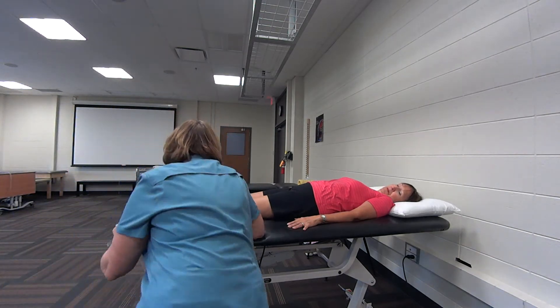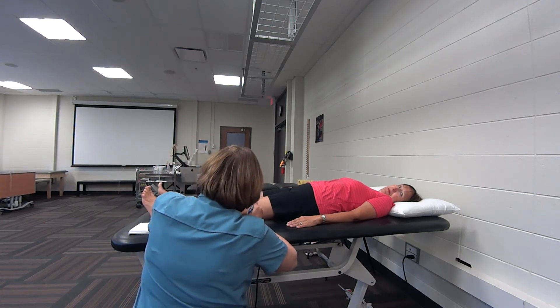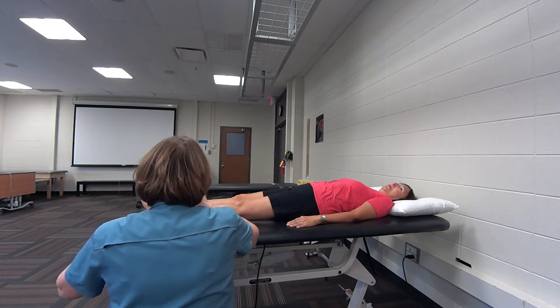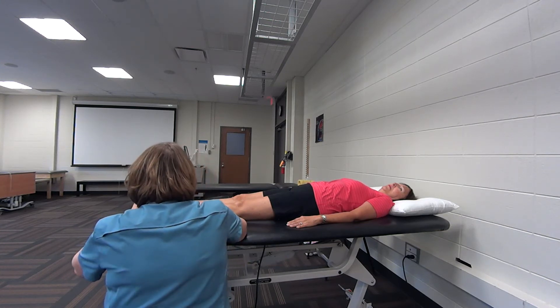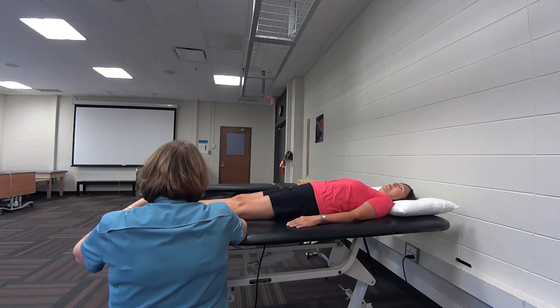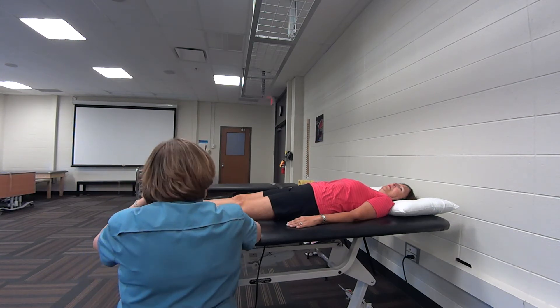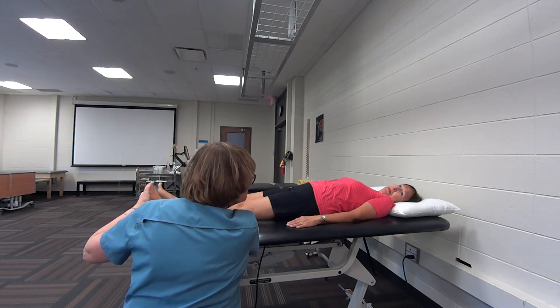So I'm just going to measure first. I'm just going to measure this ankle here, and I'm going to draw a little bit on your leg. Is that all right? Yep. This just makes sure it's easier to visualize where the lines are as you do your movement. So I'm going to ask you to pull your toes towards you. Okay, that's it - a little bit more. It's as far as it'll go. Okay, good. And relax. Now, did that hurt at all? No. So the pain's still at three - it didn't make it worse. Correct. So that was about five degrees. That's one of the reasons why you're limping - because that's a little bit stiff. So that's what these exercises are for - to make it easier for you to pull up.